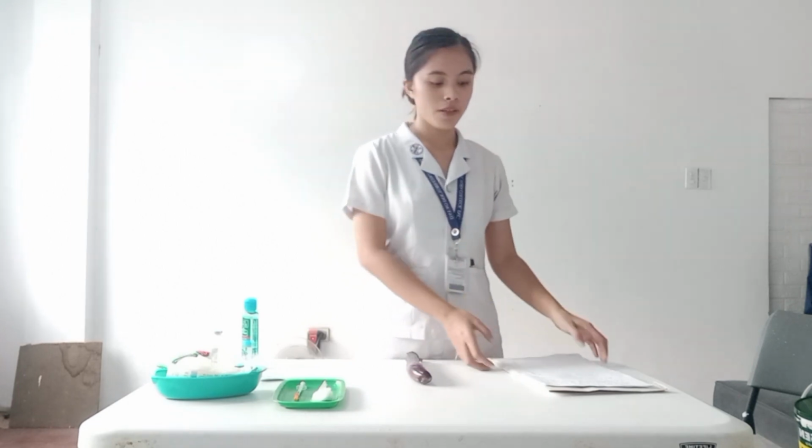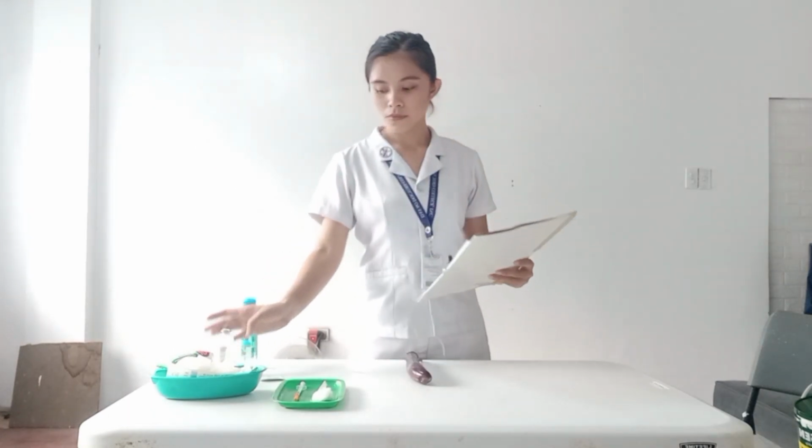After that, check the label on the medication carefully against the MAR to make sure that the correct medication is being prepared. Now in medication administration, it is very important to perform the three checks. We'll have to read the label of the medication when it is taken from the medication card, read the label again before withdrawing the medication, and read the label again after withdrawing the medication. After that, organize the equipment to save time and effort.